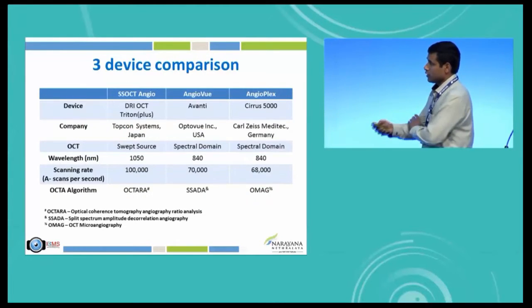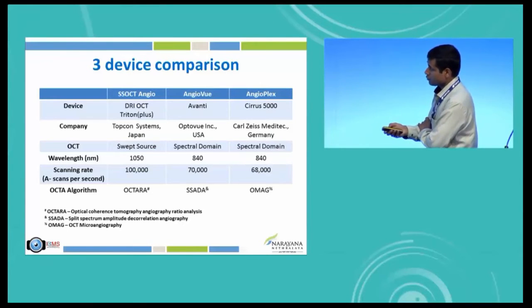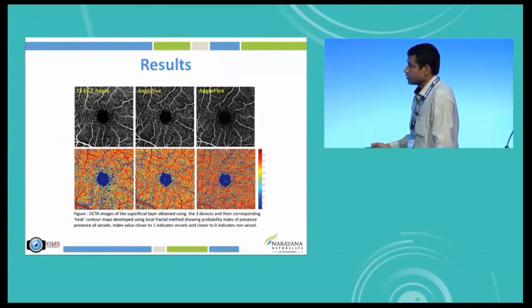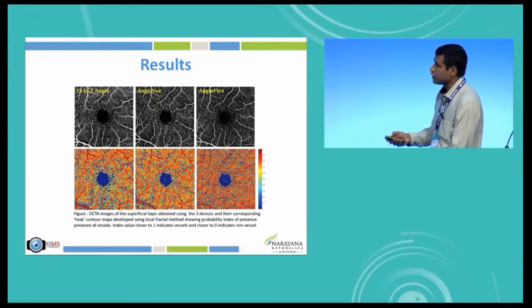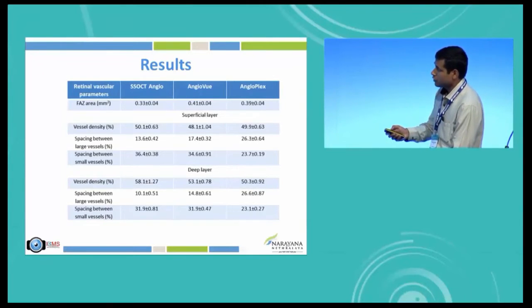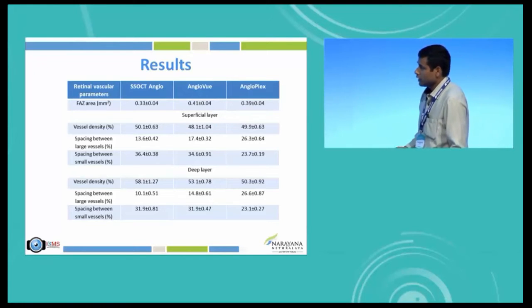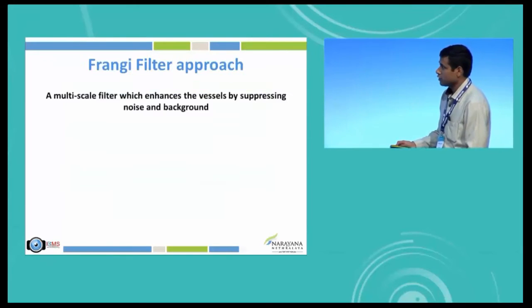We now use this technique to compare three machines: the swept source, which is Triton; AngioView; and Angioplex. They all have different features, and this is a result showing how the vascular density looks using these three machines. When you actually quantify the vascular parameters, you see very distinct differences between the three machines in terms of vessel density, spacing between the vessels, and these can be quantified in percentages as well as areas.